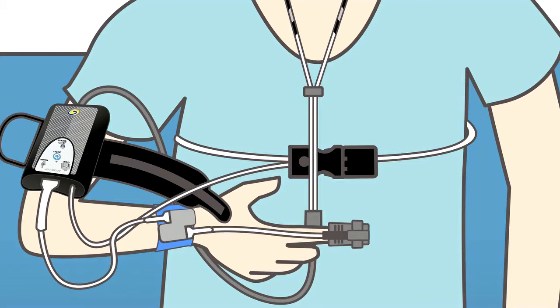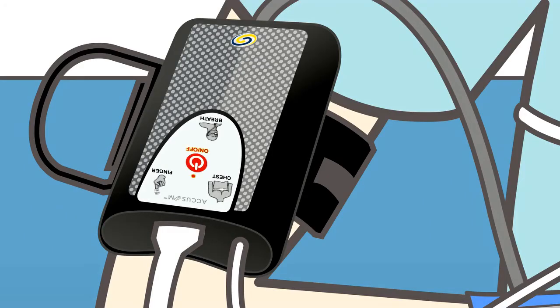Strap the device to your arm, then turn on the device by pressing and holding the on-off button for five seconds and letting go. Lights will flash orange during the system's check.